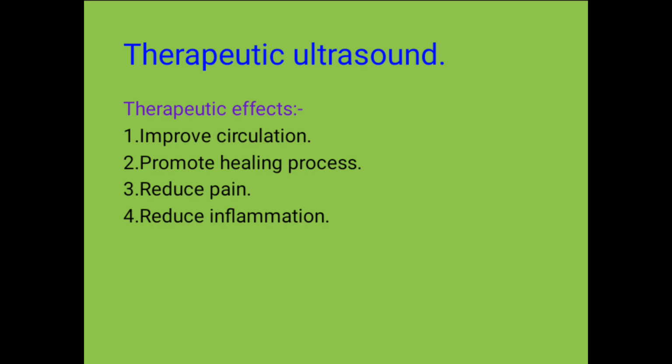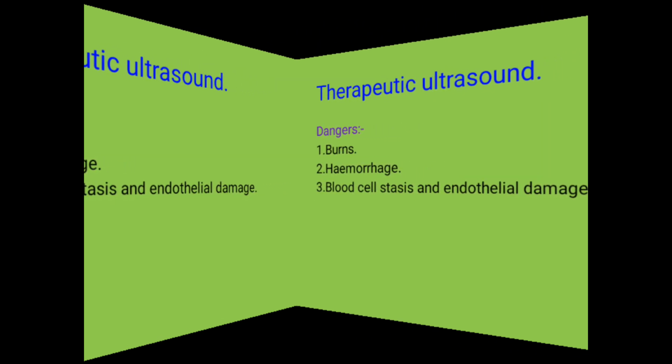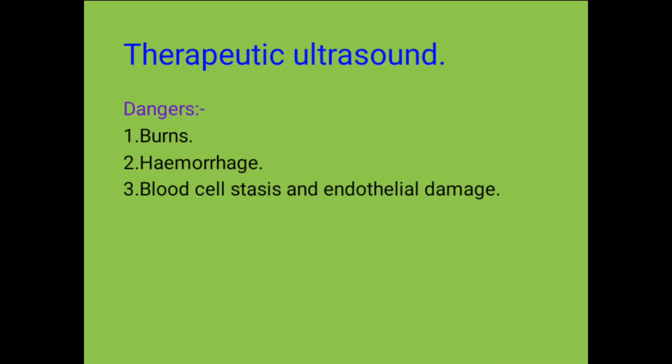So I want us to check our last part, which is on the dangers of ultrasound, and then we will be done with the lecture about ultrasound. Now, dangers: of course, if you keep the transducer on one point, you will burn your patient. So dangers: 1, burns.